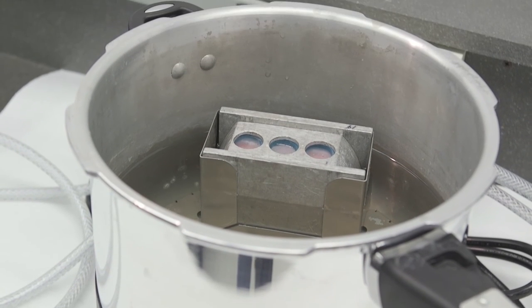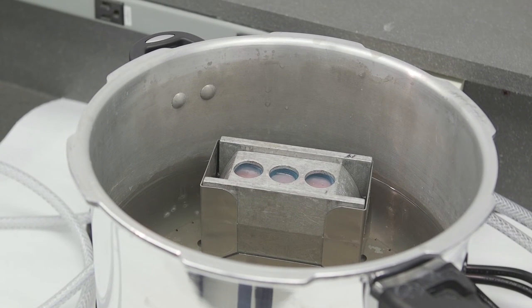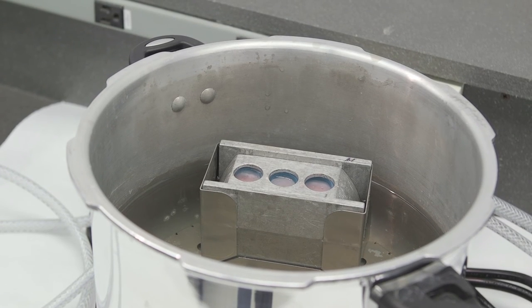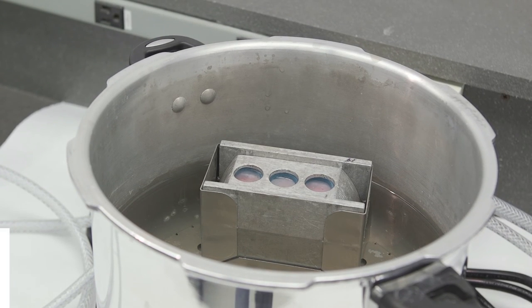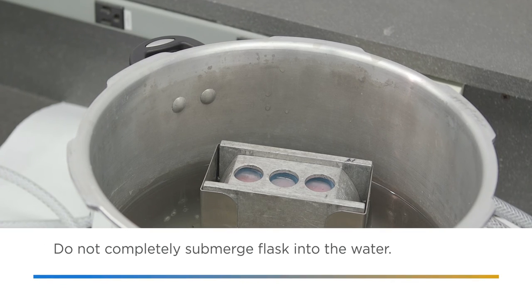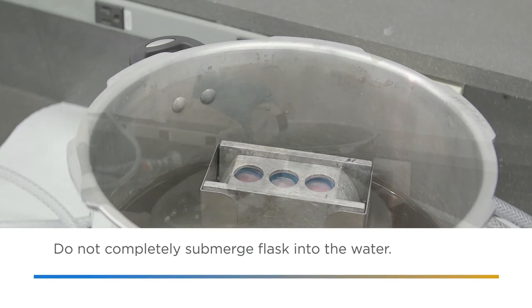Next, place the flask in the water with sprue holes upright. The water level should be below sprue height but above two-thirds the height of the flask. Be careful! Do not fully submerge the flask all the way into the water.